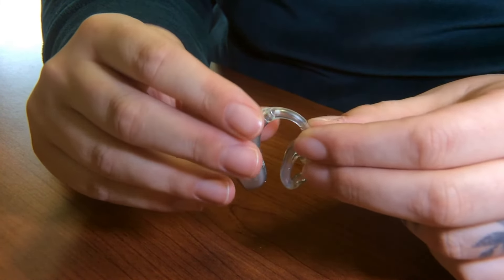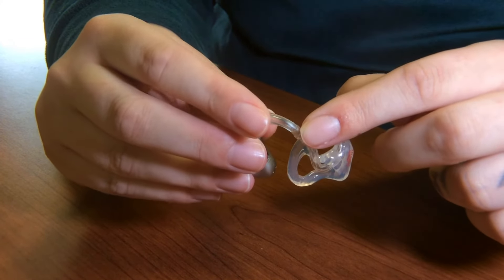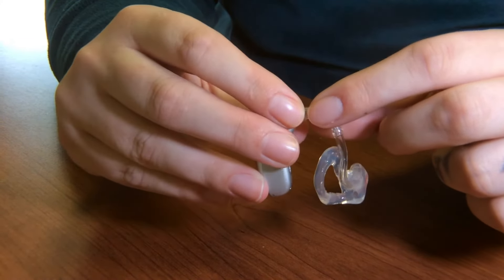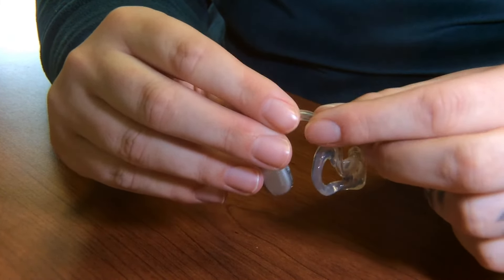Once you've cleared that, then you want to look at the tone hook, and you want to make sure that again, there's no cracks, there's no fractures in the casing, and that there is no debris that has made its way up into the tone hook.